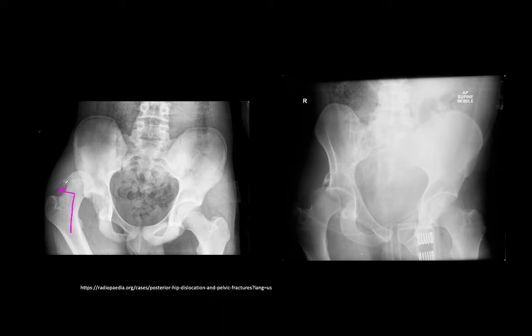So you'll notice this femoral head is not living within the acetabulum. Definitely a dislocation of the right femoral acetabular joint here. And one of the biggest concerns is whether or not the acetabulum is fractured. Remember, in 90% of posterior hip dislocations, the acetabular rim fractures. They call these dashboard injuries, and they're often very difficult to see.